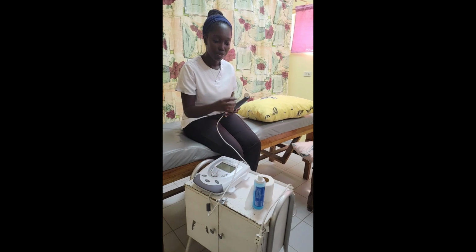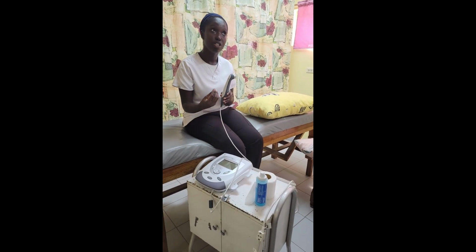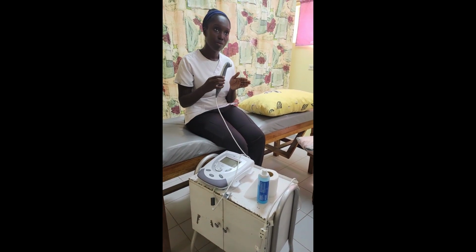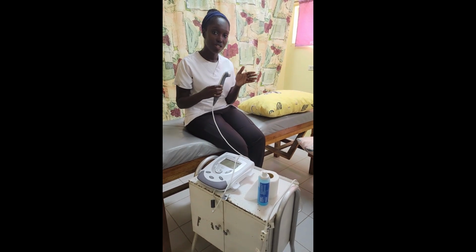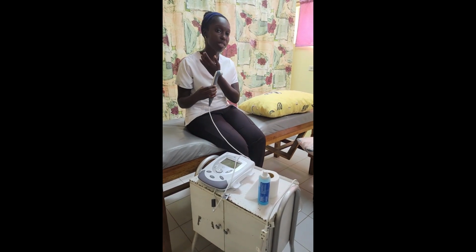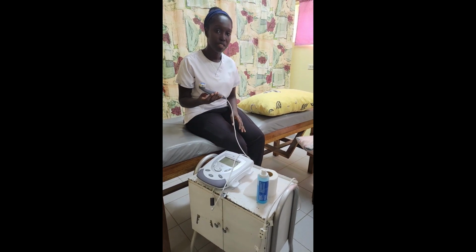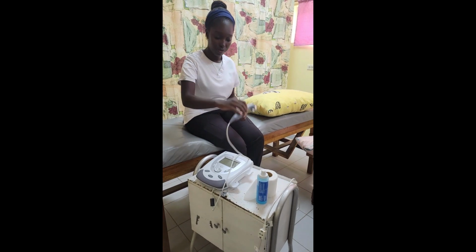So here, you will put gel on the patient, and you will set it to what degree of waves you want it to translate to the soft tissue, and you will rub it in small circular motions with the gel applied to the skin. It will emit the rays to the soft tissue, and patients usually improve with this. However, note that this cannot be used on the spine itself.